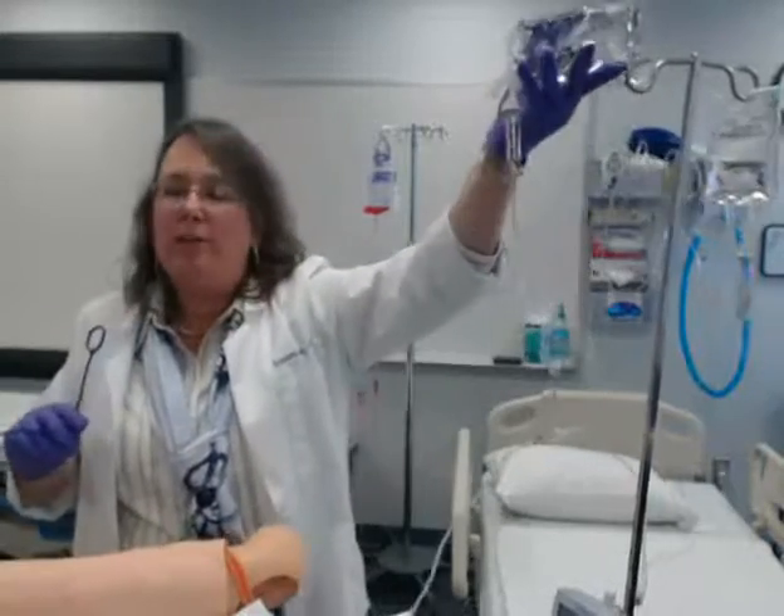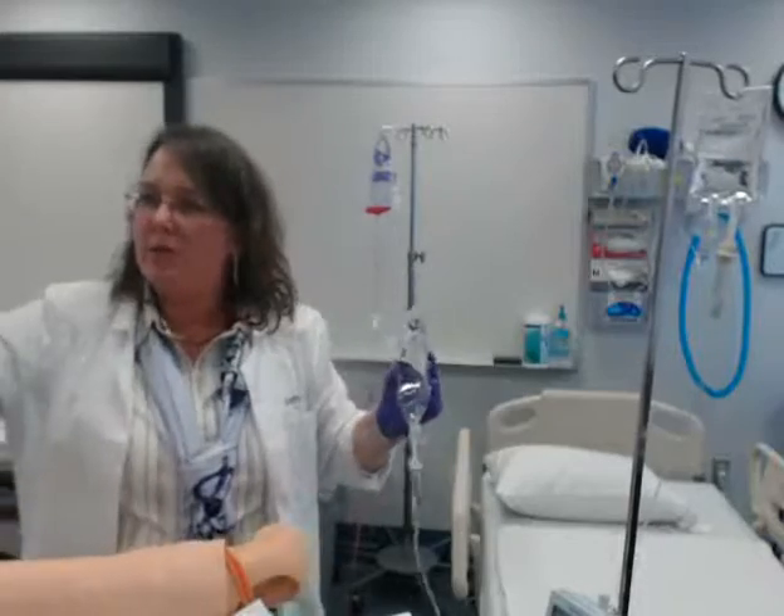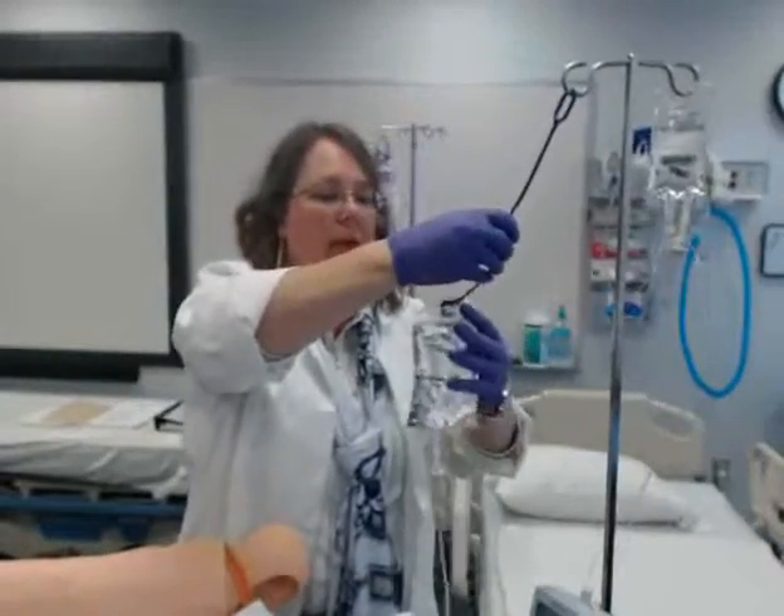In order for that to happen I have to have the primary bag lower — that's what this hook is for. I'm going to put my primary there.